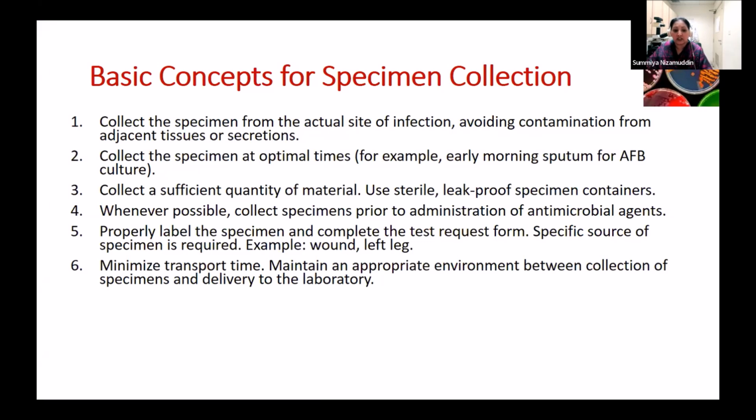So you have to emphasize the fact that the patient is informed that the sample should be transported to the lab as soon as possible. And if they do take the sample home, for example, they must also be informed about what environment and at what temperature the sample should be kept, and then delivered to the lab immediately. So this is once again very important, and I'll be talking about what would be the appropriate temperature to hold a sample in my following slides.